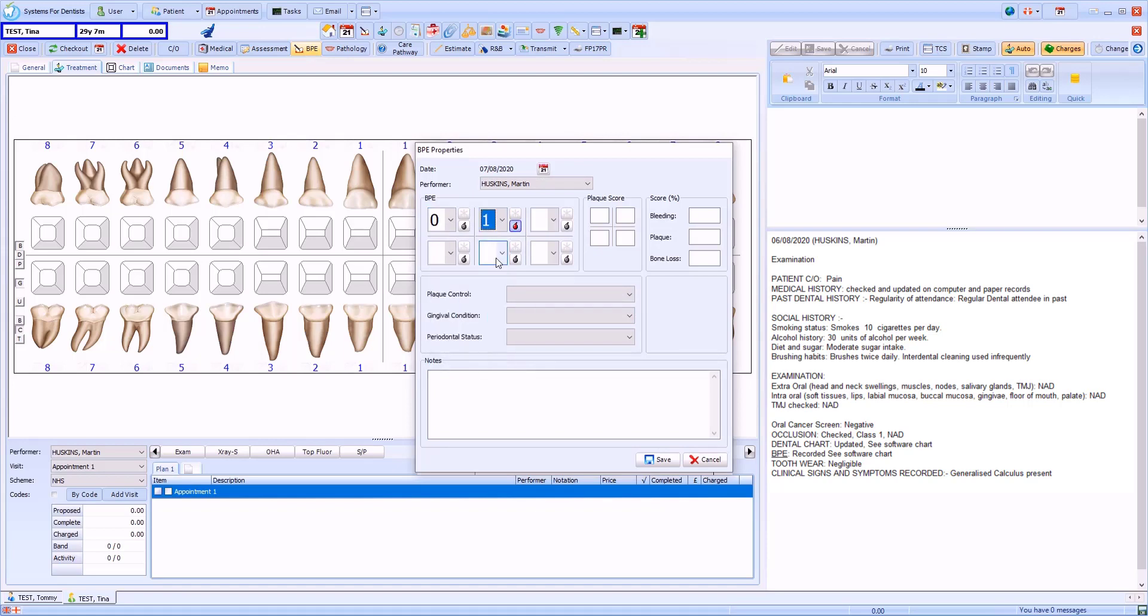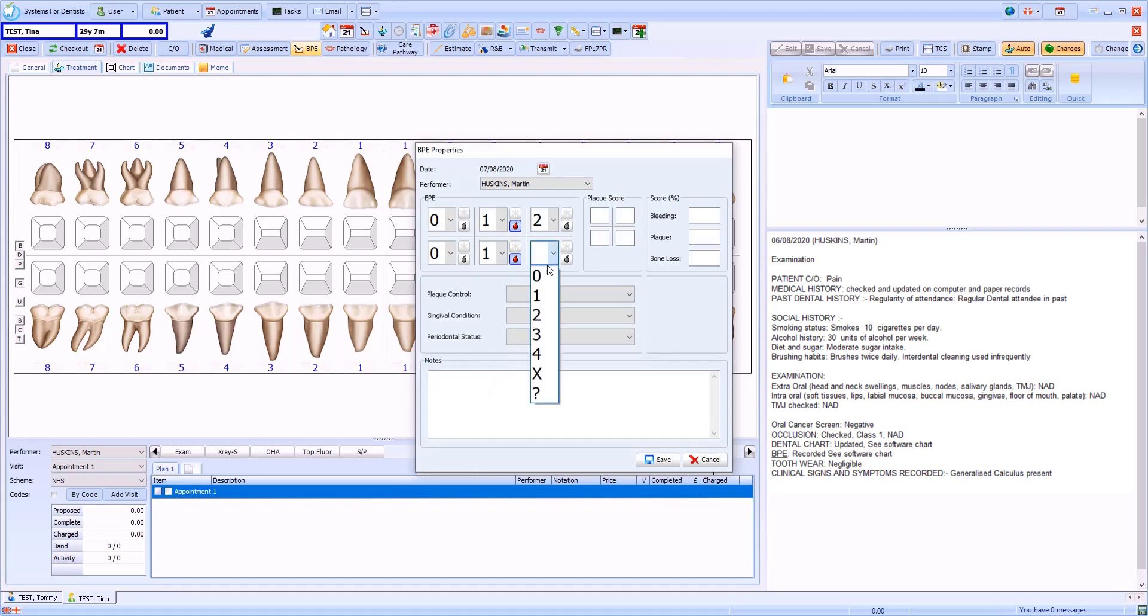Note that if you enter a value of 1, the presence of bleeding is automatically marked. You can also select this for other values if required. The star icon allows you to indicate the presence of furcation.